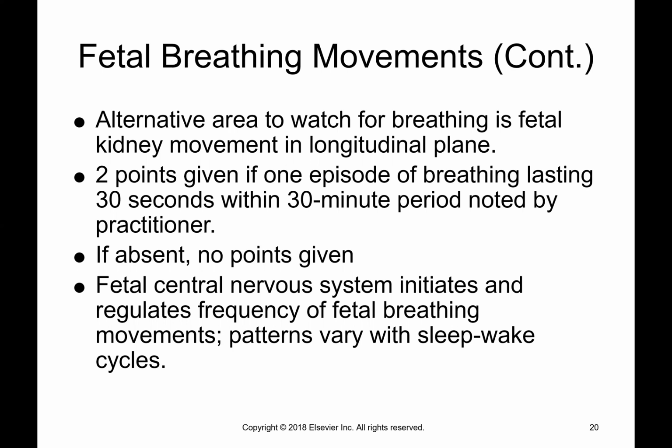Even though they want to extend it to 30 minutes, I struggle with passing the baby because they should be really breathing within that time. Sometimes when they're in a deep sleep, it gets kind of difficult to wake them up, but within 20 minutes, they should have started breathing a little bit. The fetal central nervous system initiates and regulates the frequency of the fetal breathing movements. So the patterns may vary with sleep and wake cycles. So sometimes you have to try to wake them up by moving the mom, kind of jiggling the mom, or have the mom drink some water, which sometimes perks them up.